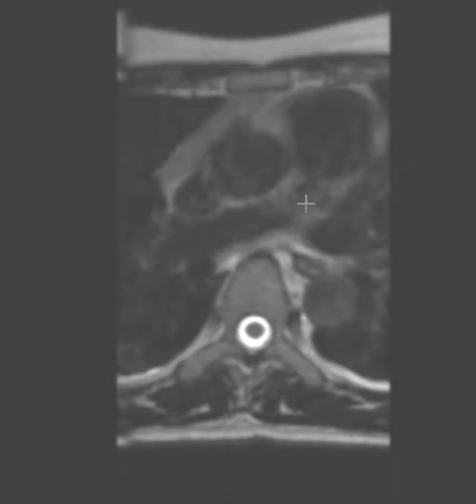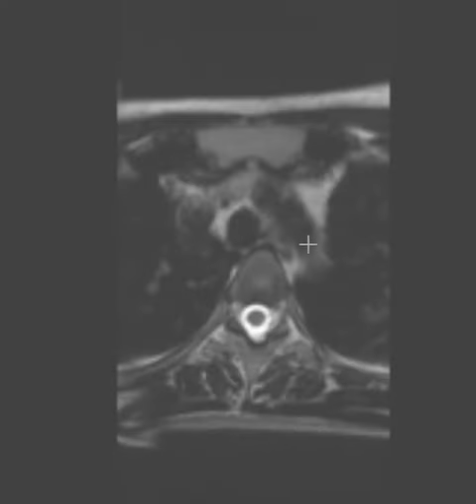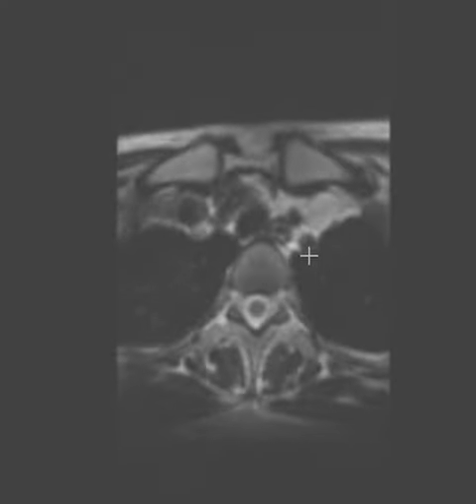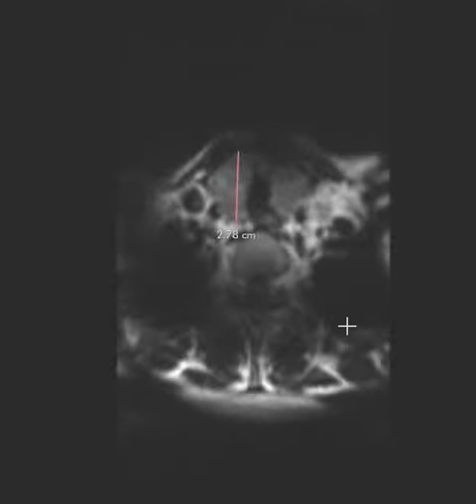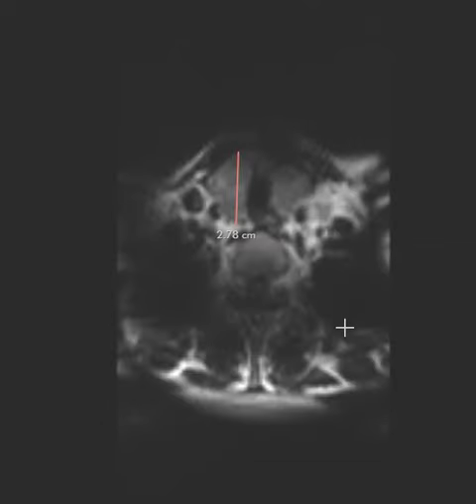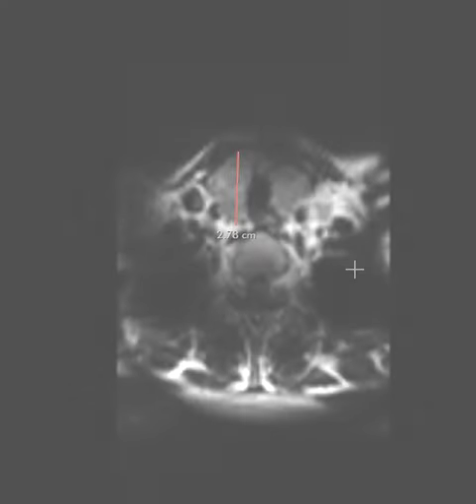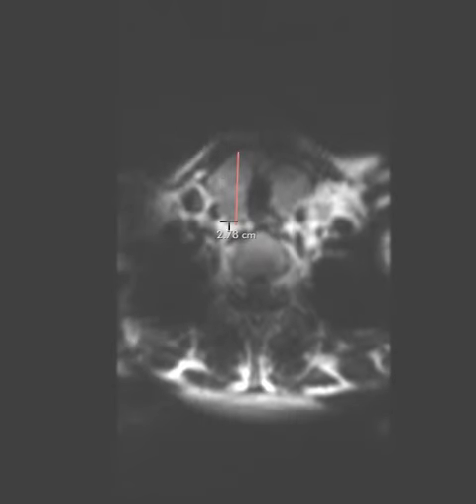If we go on up here we're going to find the thyroid gland in the short axis images. This is where we see it best. This is at the very top so they just fall off, we don't see them, but right there we catch it. We see the thyroid gland is this tissue right here, it's like a horse's saddle and it drapes over this middle thing here, the trachea, the airway.